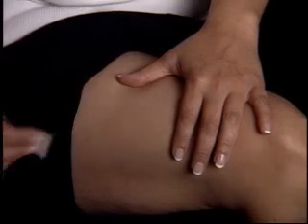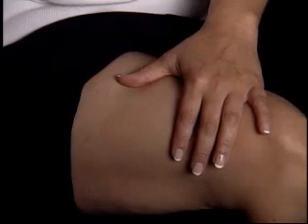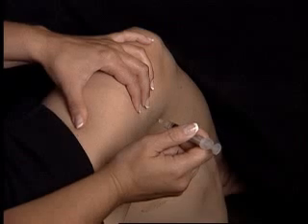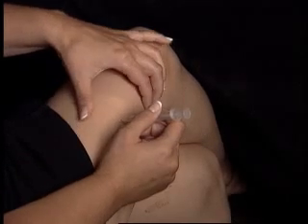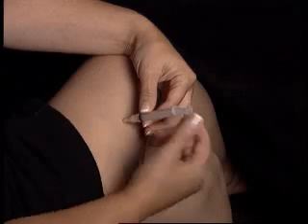Cleanse the site with an alcohol wipe and allow to dry. Hold the syringe like a pencil. Using a dart-like motion, insert the needle into the skin.